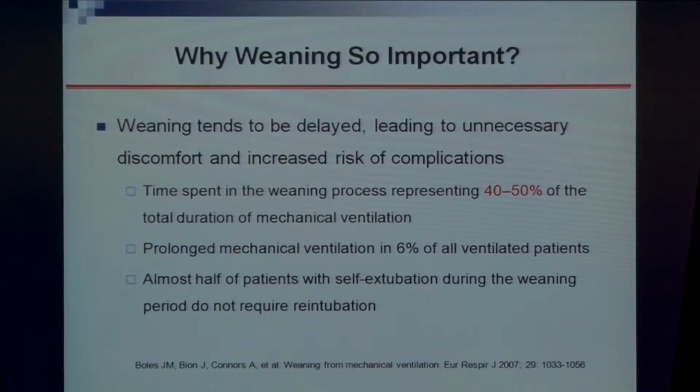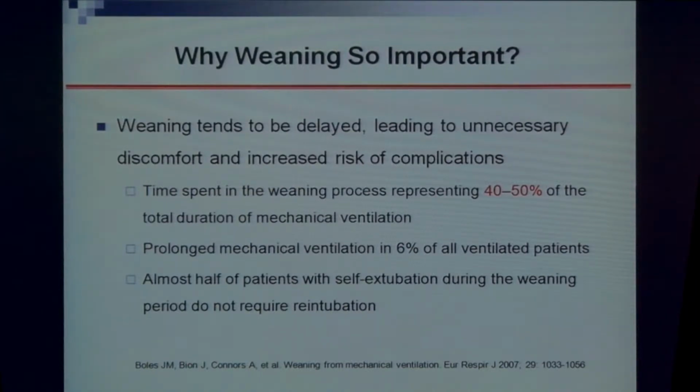As we know, about 40 to 50% of the duration of mechanical ventilation is spent in the weaning process. Prolonged mechanical ventilation happens in 6% of all ventilated patients and is also associated with pretty high mortality. With respect to the time point of weaning, as demonstrated before, almost half of the patients with a self-extubation during the weaning period do not require reintubation.